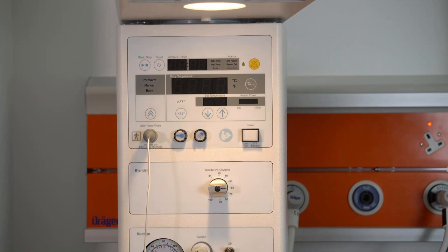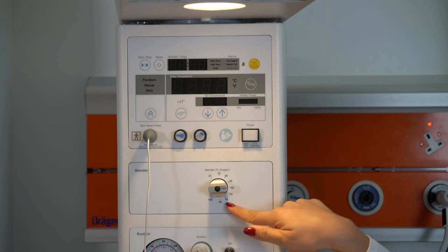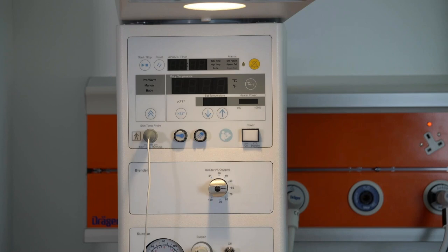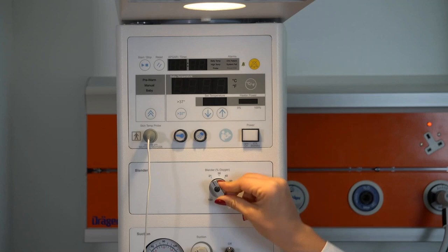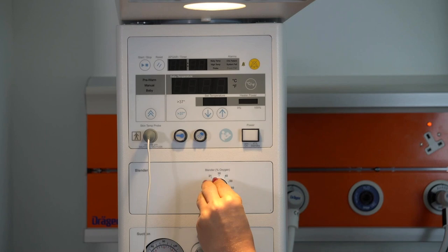And once I turn on the device by using this power button, we can also lock the screen to avoid any unnecessary adjustments. We have an integrated blender. So that means you can actually deliver blended air to the baby. So the blender works from 21% to 100%. So again, what Linda was referring, depending on the saturation, depending on the baby condition, we can decide on the FiO2 settings for every patient.